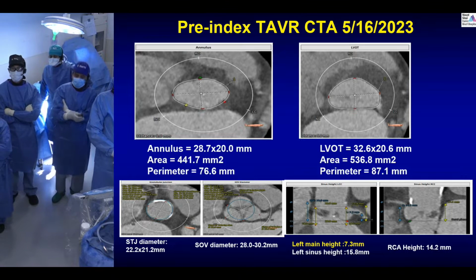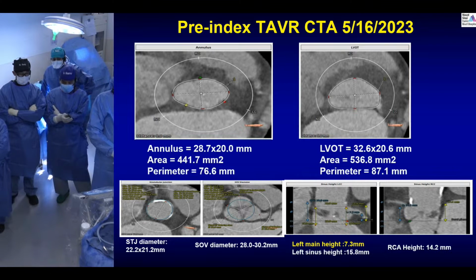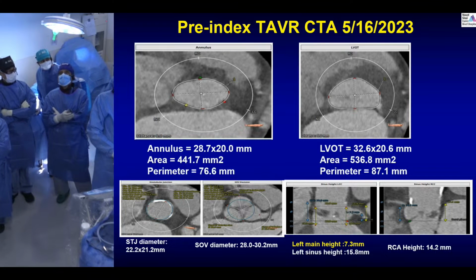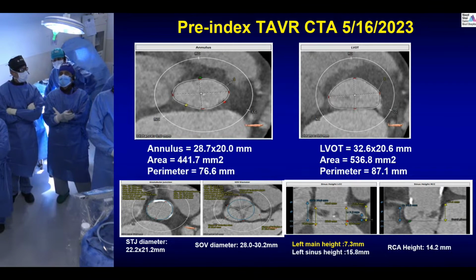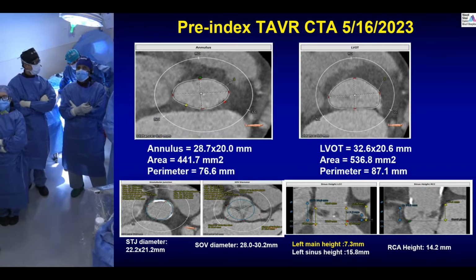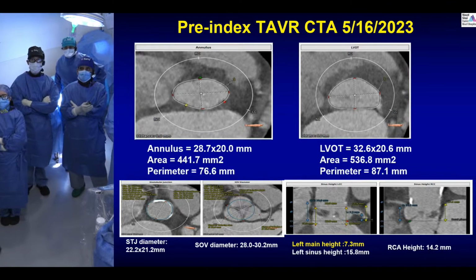Right. So let me ask you, let's say we are here, Back to the Future, and we are in May 16, 2023. Knowing what happened to this patient within 15 months, what would we have done differently at that time? Anything we can say? I mean, if this were done here, I think we wouldn't do anything different. I think we maybe added more volume to try to make sure there's no PVL left at the end of the procedure. And, you know, I think that's one area that we would have to maybe monitor more closely.